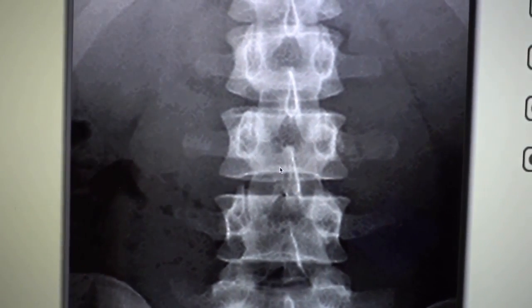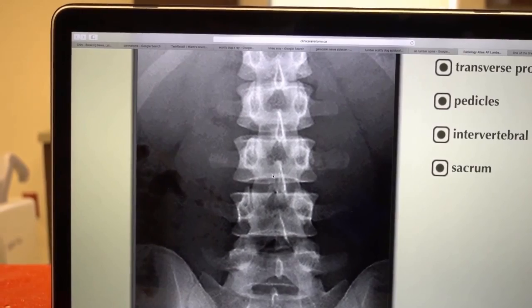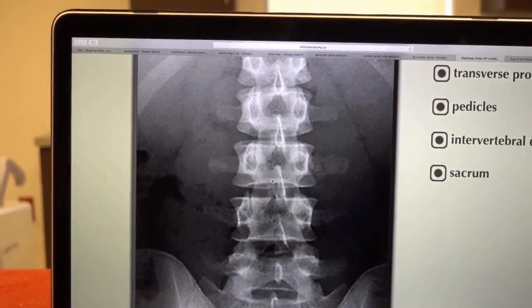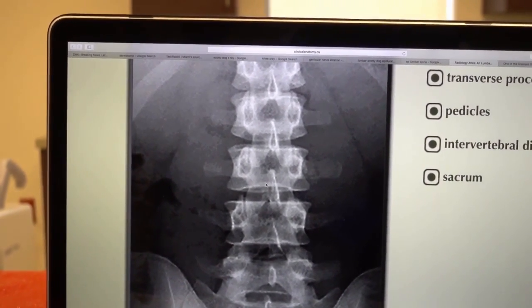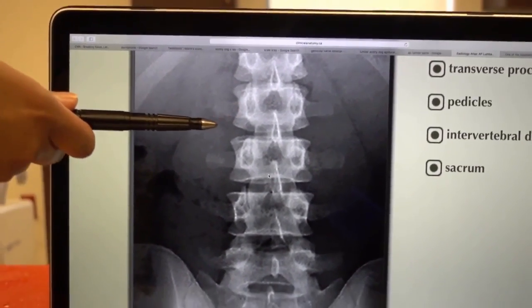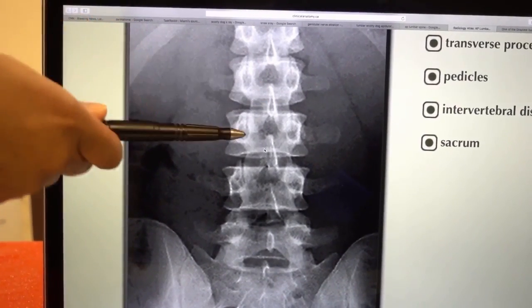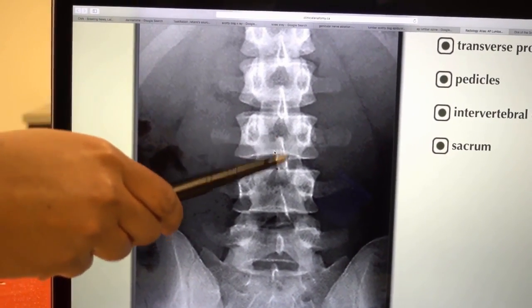They're not straight. So they're more to exactly the right. And so what are you looking at on the spinous process that shows you that it is AP? You see some white lines, correct? You see both of the lines on L2, you see both lines here, yep, and on L3 and 4 you only see them on one side.